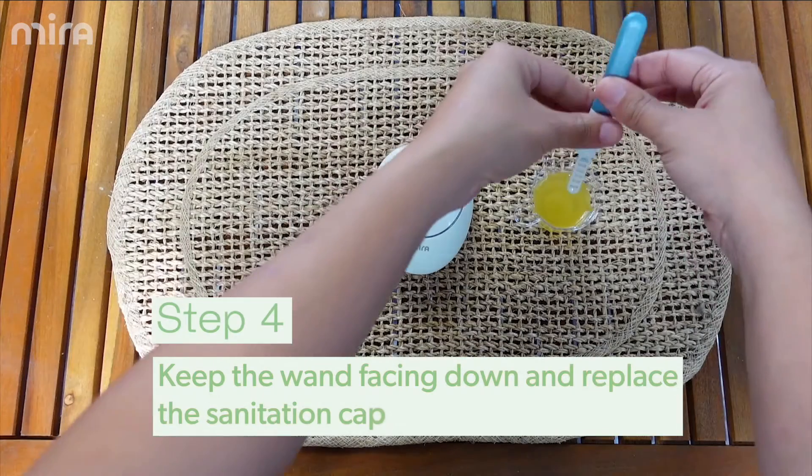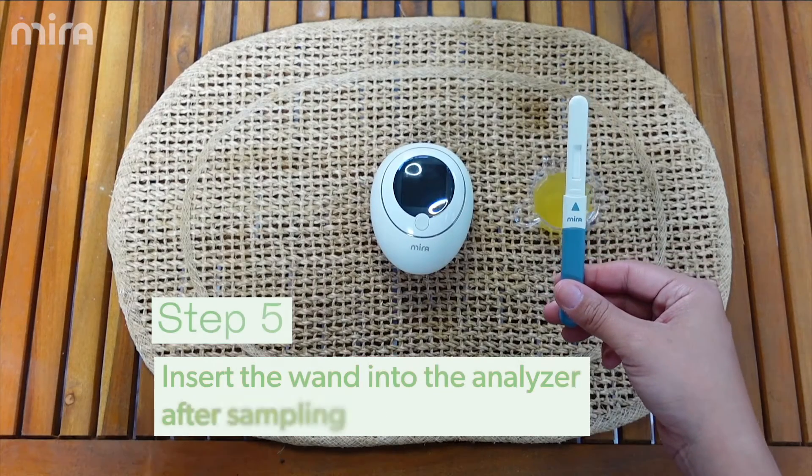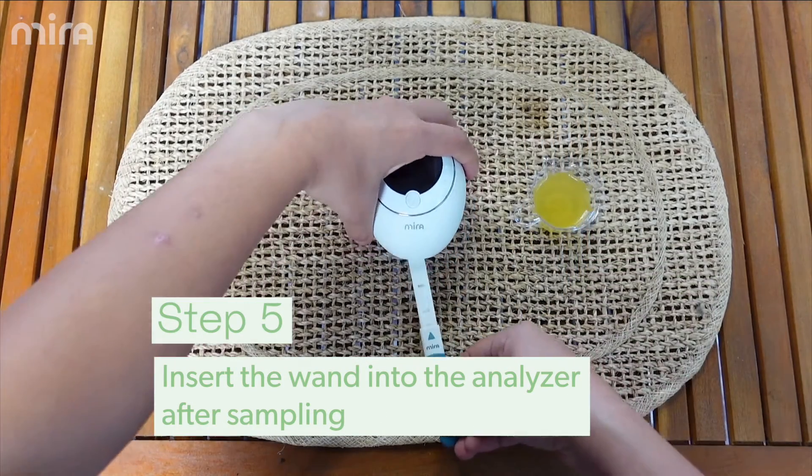Step four, keep the wand facing down and place the sanitation cap over it. Step five, insert the wand immediately into the analyzer after sampling.